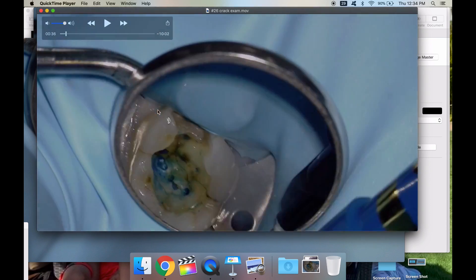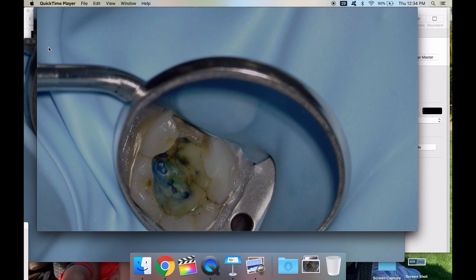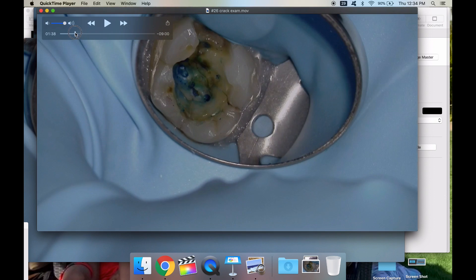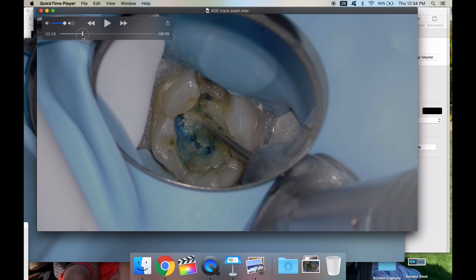I'm going to place Opal Dam — this is critical, super critical. You should be using a rubber dam; I'm huge into rubber dams, that's standard of care. I'm just poking there to see if there's any access.